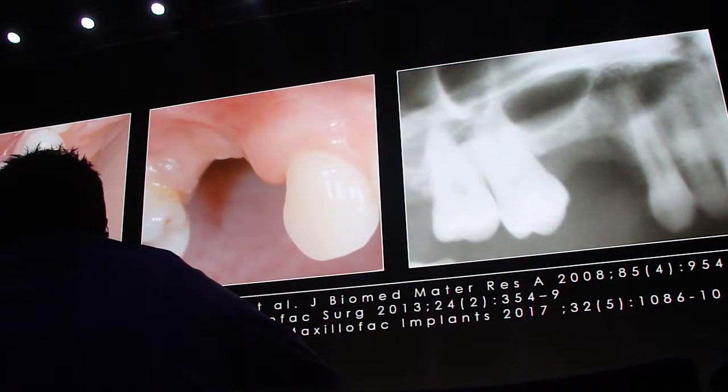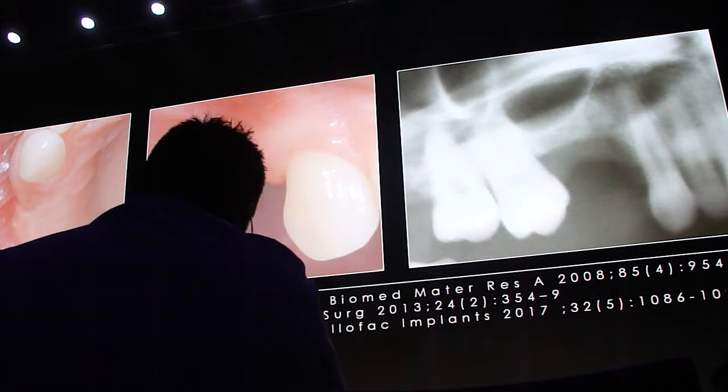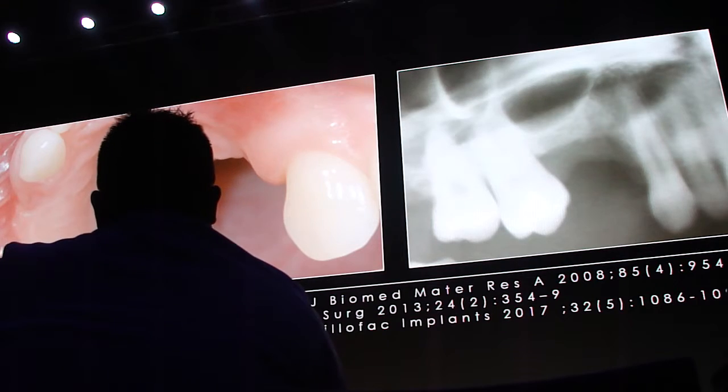Another case, another vertical defect, and another problem. This patient, she is a vegetarian, and she denies any type of animal products. And I think also we as surgeons should be very critical of the products we are offering our patients. And fortunately, Dentsply is offering us a huge range of different grafting materials to react to this specific situation.